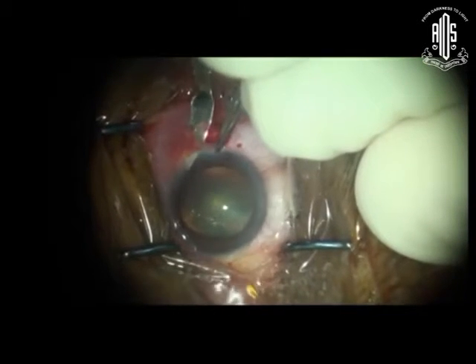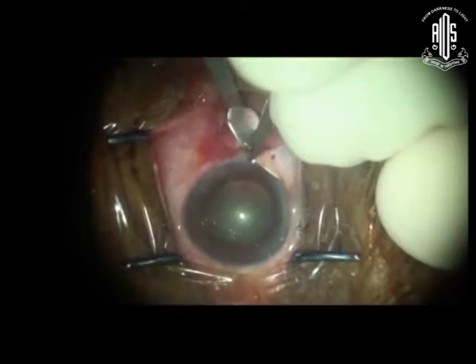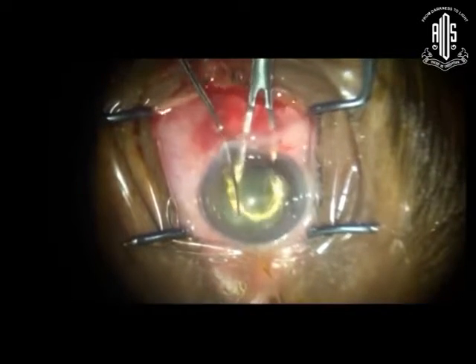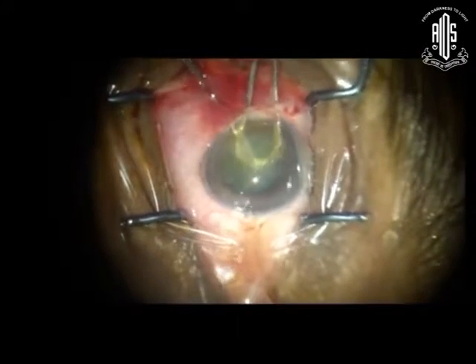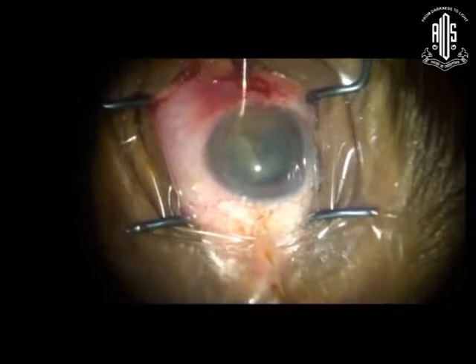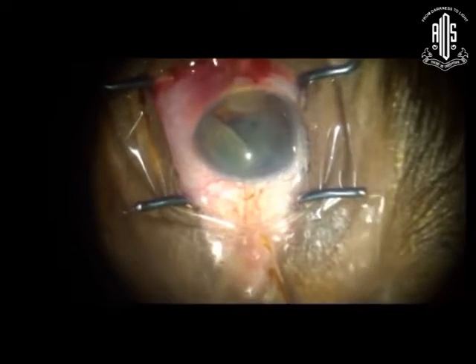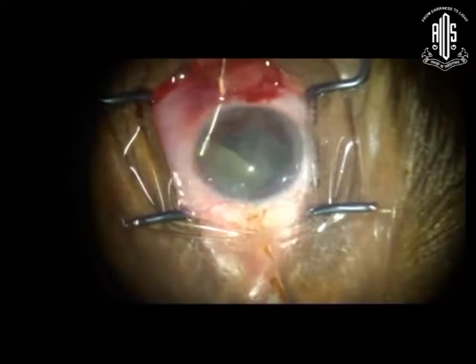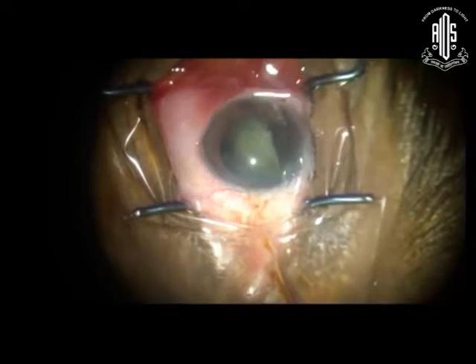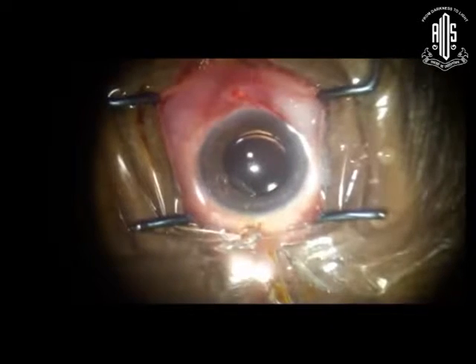The tunnel is being extended. And he delivers the nucleus with a sandwich technique after bisecting the nucleus into pieces. Surgery is complete.